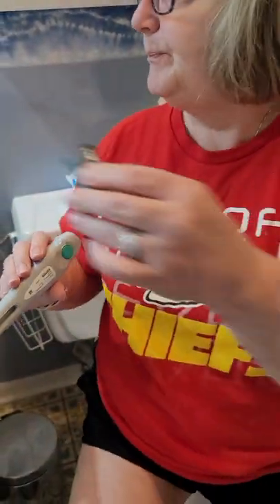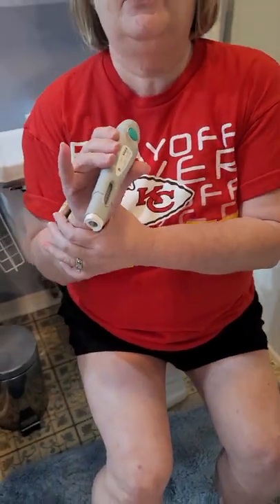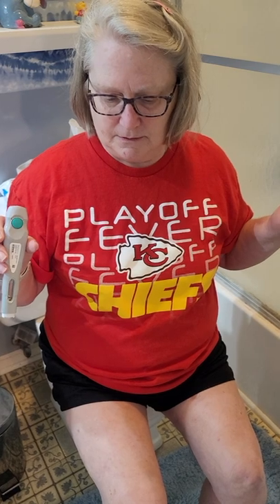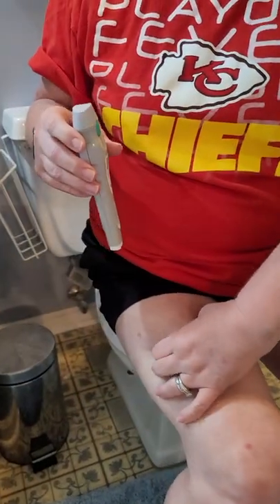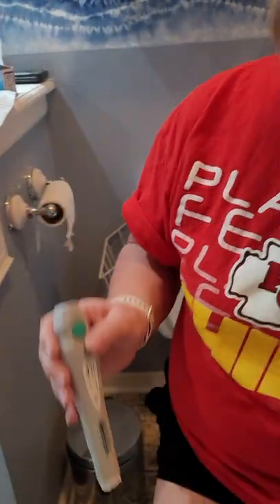There's the white part. My pulse is 105. Deep breaths. I'm okay. So it says to pinch — pinch my skin. See my leg. And then I'm going to push it down. It says to push that white thing flush. As soon as I push it down, then I push this green button, and it says approximately 15 seconds for the plunger to go.